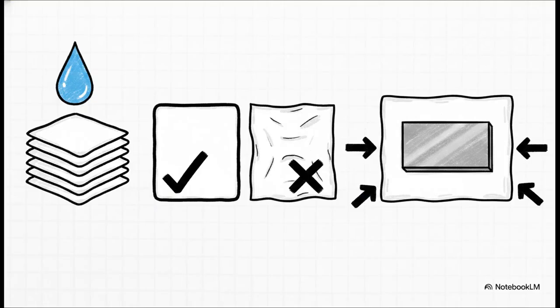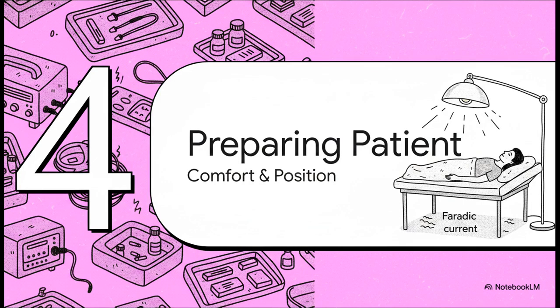Those could be a pad, a specialized pen, or a classic metal plate. Speaking of plate electrodes, if you're using them, listen up, because these rules are vital. Your active electrode has to be meticulously wrapped. The standard specifically demands covering it with at least 8 folds of moist lint. And those folds have to be completely even, 0 creases, completely moistened with absolutely no dry spots. Plus, the lint has to extend past the plate by at least 1 centimeter on every single side. I know it sounds super specific, but this level of precision is exactly what guarantees a safe, totally even distribution of the current.